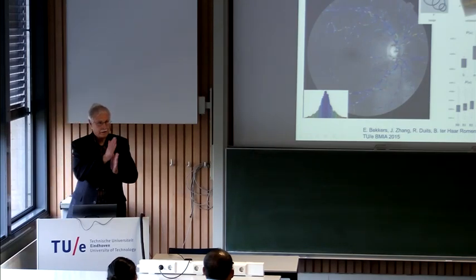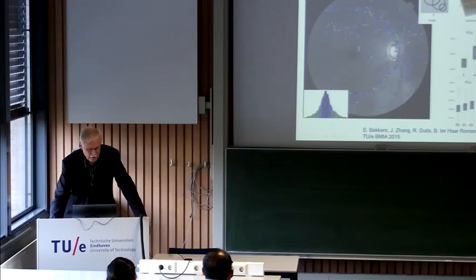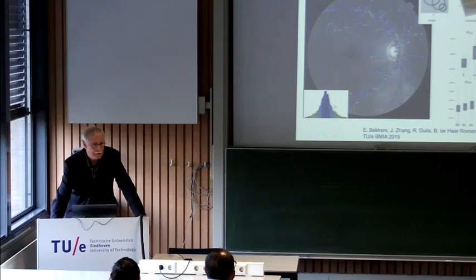So the histogram of all these thousands of curvature measurements is a very narrow histogram around 0. If you now look at patients, you see much more positive and much more negative curvature. So the spread of this histogram is a measure for the degree of early damage to the retina. Here you see healthy and diabetic retinopathy, quite a big difference in the curvature, and this is the standard deviation of the fitting Gaussian to this curvature. Simple measure, but it works quite effectively. So we now have a quantitative measure.